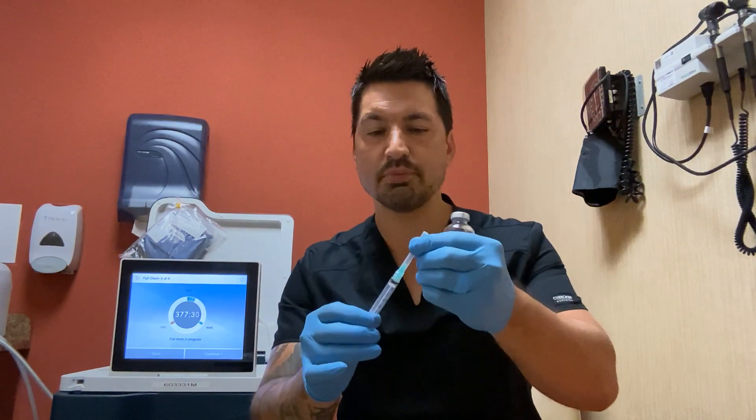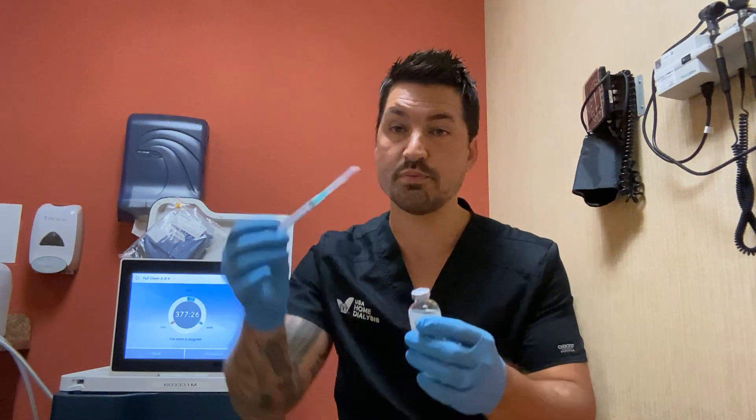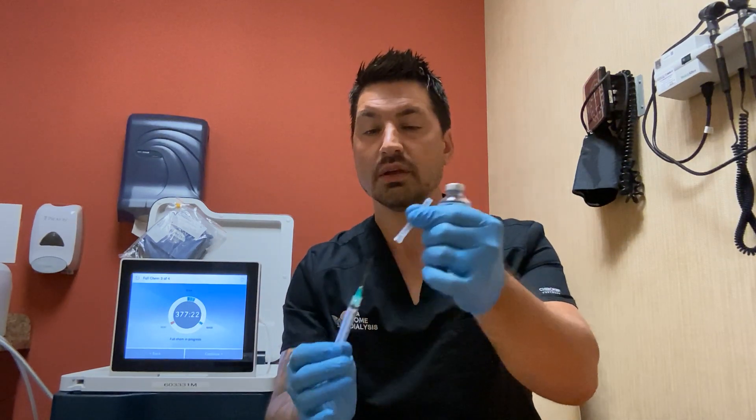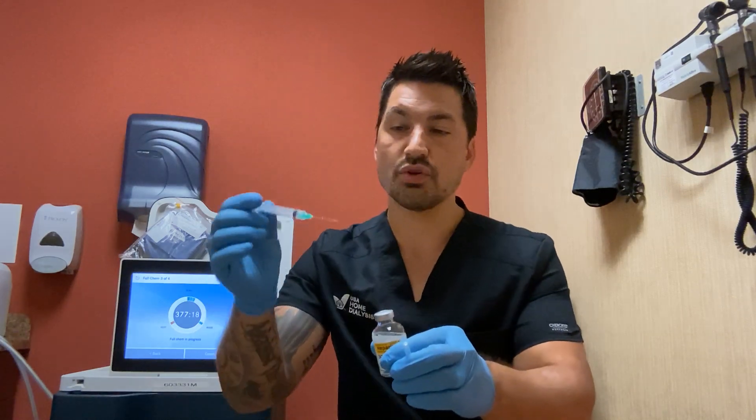The needle — it's simple righty-tighty, lefty-loosey. You want to keep the needle on when you puncture your medicine. So give it a little twist to the right, make sure your needle's tight, and remove the cap.